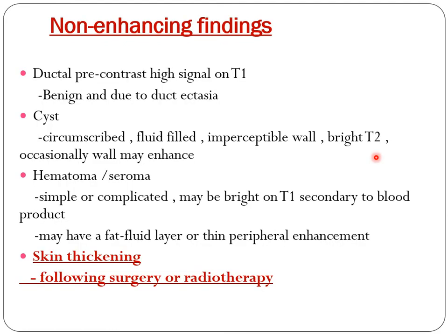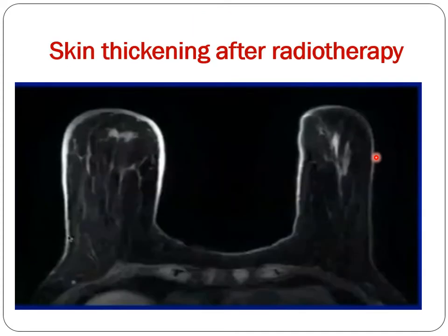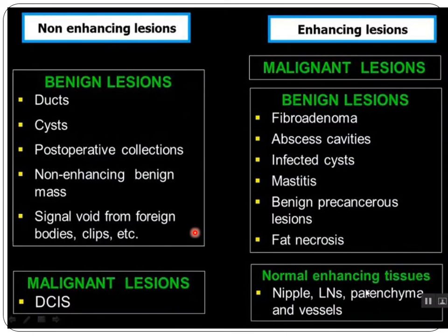Skin thickening following surgery or radiotherapy. Here in this picture there is skin thickening, and sometimes this skin thickening does not take contrast in the subtracted image. So, non-enhancing lesions and enhancing lesions, briefly. All the malignant lesions take contrast enhancement. The only exception, which is just 1% of malignant lesions that do not take contrast enhancement, is ductal carcinoma in situ.